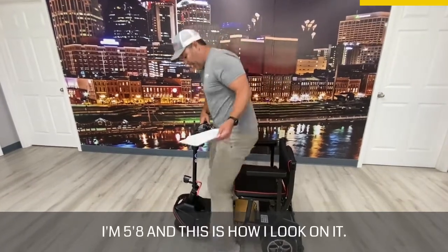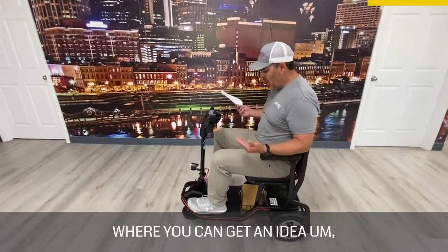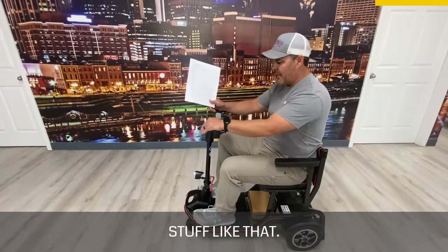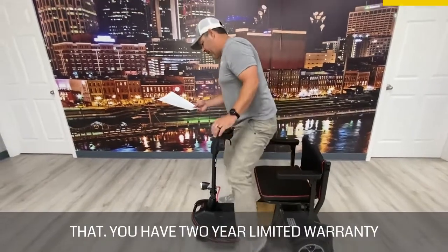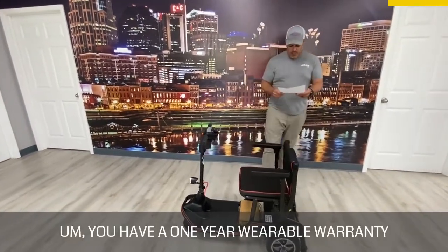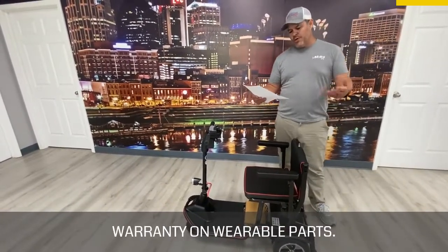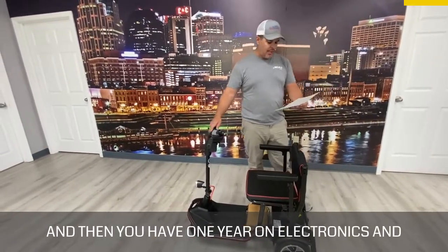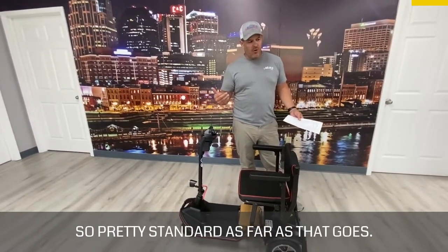I'll give you an example — I'm 5'8 and this is how I look on it. I like to always show people so you can get an idea of the height and understand what you're dealing with when you order online. You have a two-year limited warranty on the frame, a one-year warranty on wearable parts, one year on electronics, and a six-month limited warranty on the batteries — pretty standard as far as that goes.